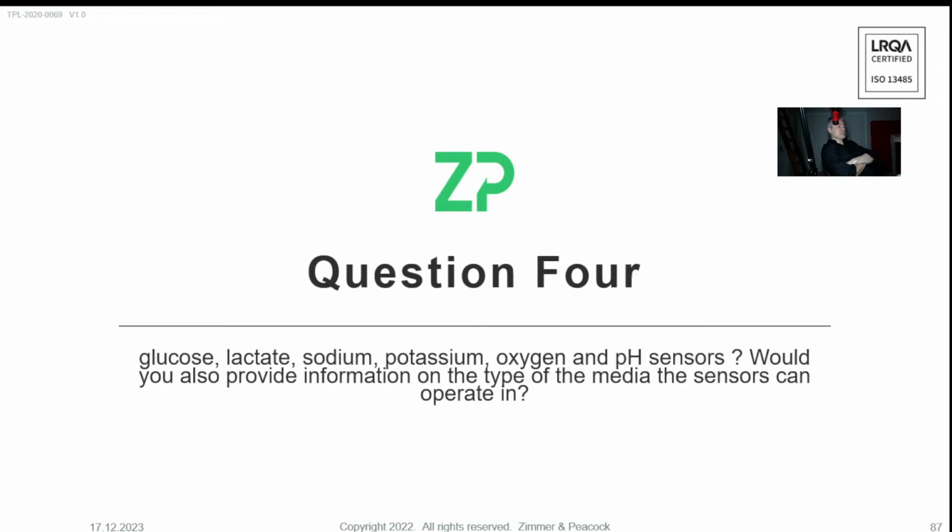What I would say about these sensors is they will all work in liquid samples. They love liquid samples. But every time you go to a new liquid, you still have to do development work. For example, if you have a glucose sensor, you would have one calibration factor if that glucose sensor was to be used in blood, but a different calibration factor if it was to be used in sweat or interstitial fluid. So there's always a gap in science, or a gap that always needs filling in.